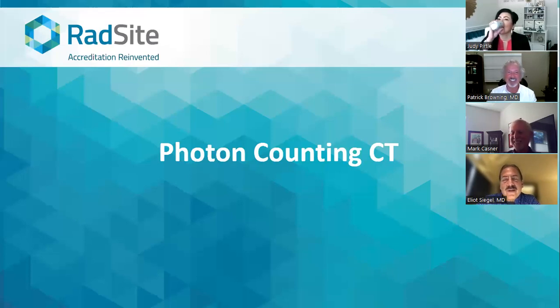But there have been some really cool advances in CT. Multispectral CT has been a really interesting possibility for being able to better distinguish between intravenous contrast and calcium, and to better characterize a variety of different changes in soft tissues. It hasn't caught on as much as the fascinating possibilities might suggest. There have been lots of academic talks on it, but it has not been as broadly implemented as one might imagine, even though it's a relative free lunch where you can do it without a significant amount of additional radiation. Iterative reconstruction was taken from nuclear medicine.